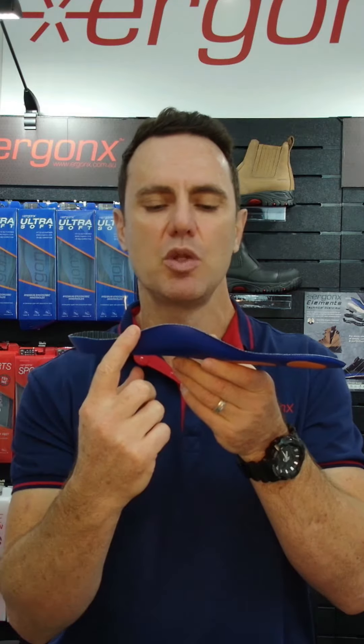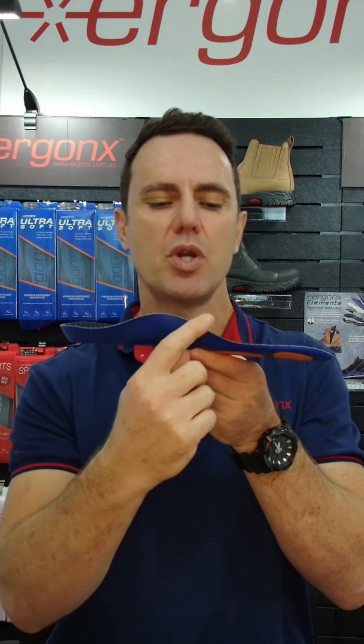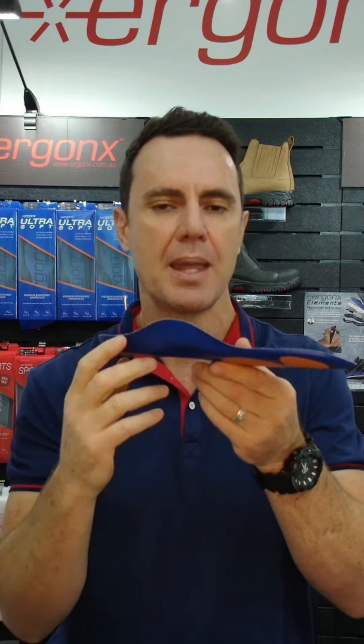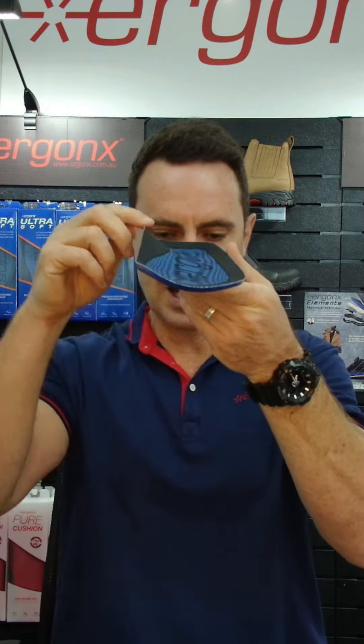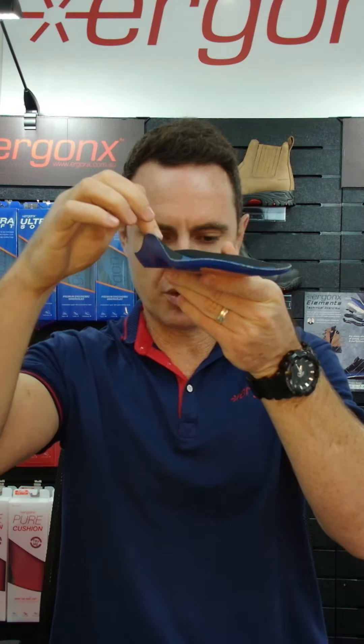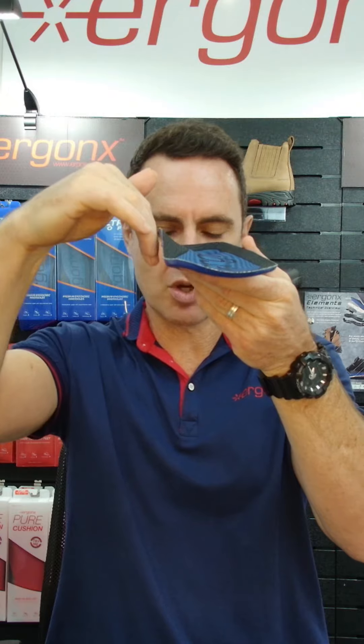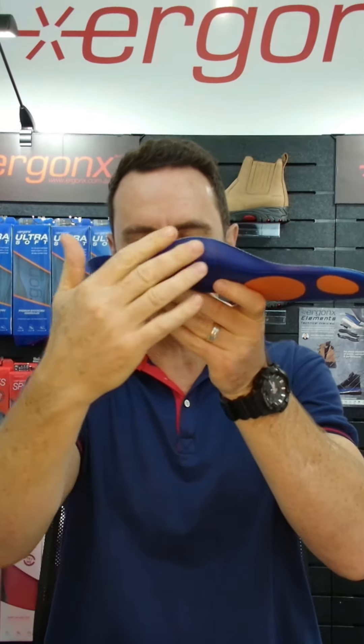The first thing we look for is whether the arch support is nice and long and high, and whether it matches your arch shape. The other thing we look for is whether the arch support comes out into the middle of the foot — you can actually see this does pack up the arch, so it doesn't just end right on the side of the shoe and it's not just a facade of an arch support.